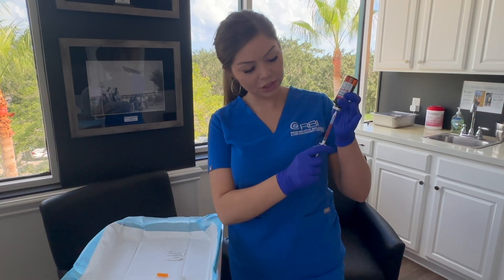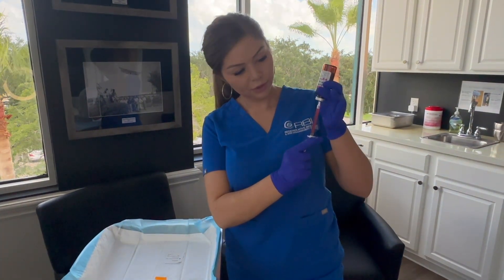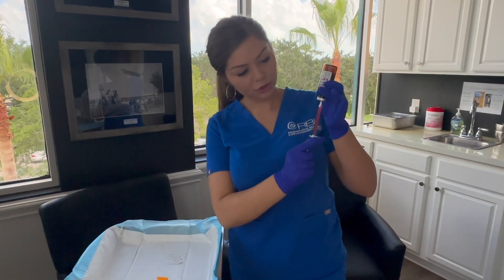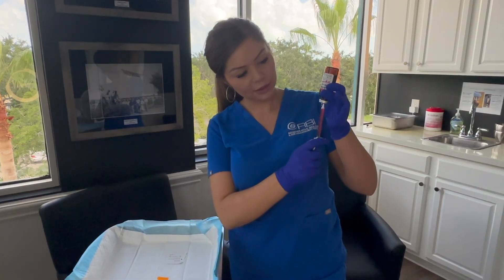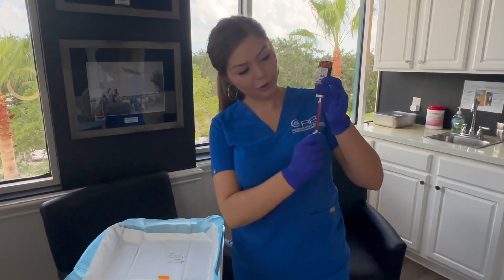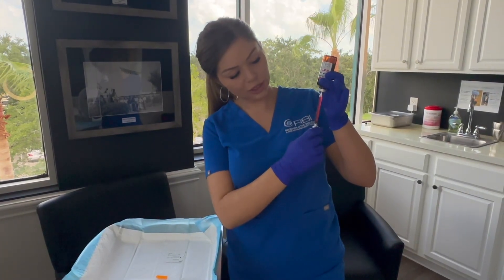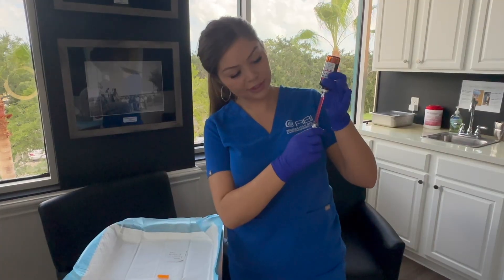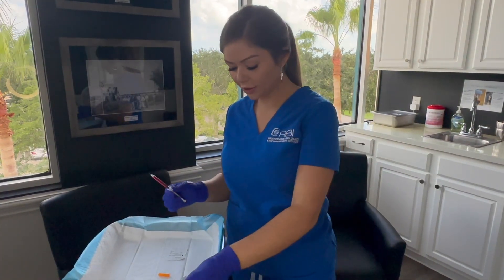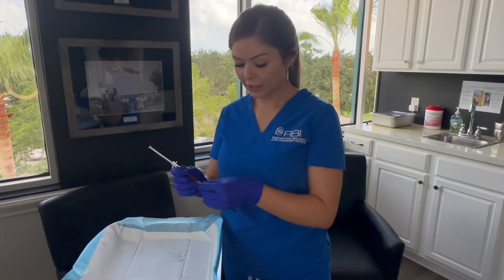This medication is generally injected once a month. Make sure there are no air bubbles in the syringe. You can pull back and forth until you get all the air bubbles out. Make sure you have that full cc drawn up, then remove the syringe from the vial and place the cap on the syringe until you're ready to inject.